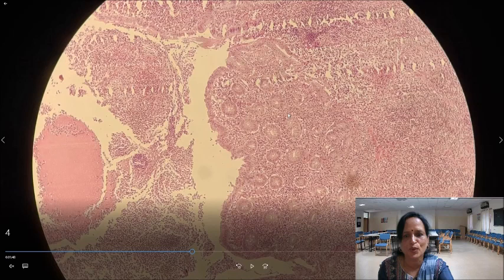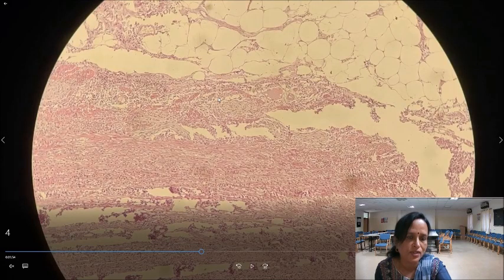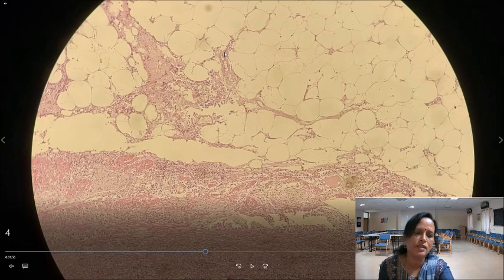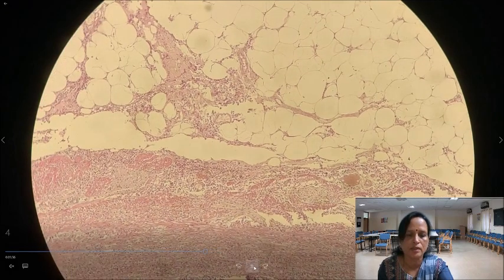Yes. So here you are seeing the muscular layer, serosa, and what else? What is extra that is seen here? This is the periappendiceal fat. So what has happened? The inflammation has spread to the surrounding fat. See, normally histology of fat, we don't see any cells like this, which are aggregated. So all these are neutrophils which are there in the septa.